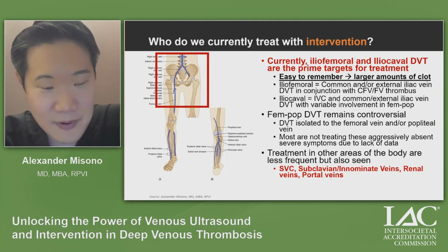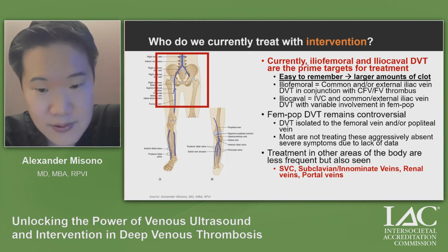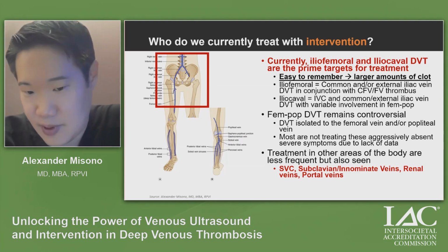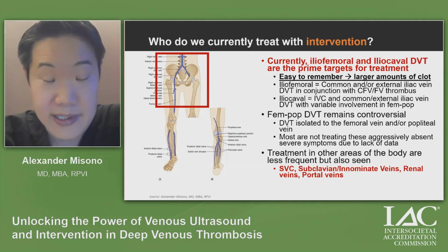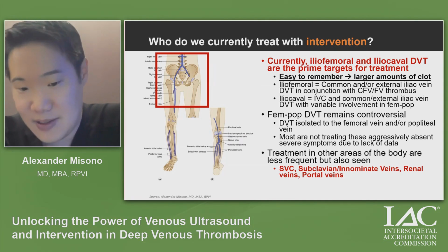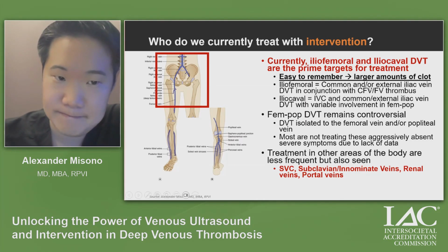Note that I am focused a lot on the legs today because I think that's where the epidemiology drives us. That's where most of our patients are, and that's where we see some of the most debilitating conditions related to DVT. However, we can treat in other locations as well, whether it's the SVC, the upper extremity veins, even visceral veins.